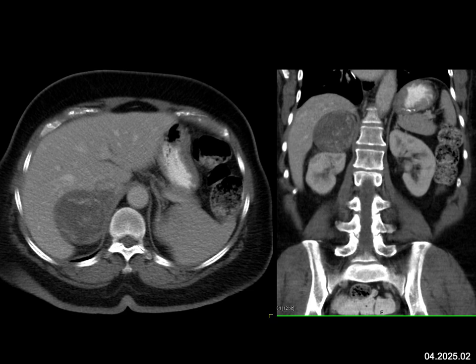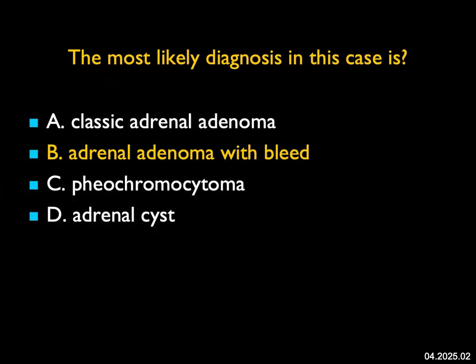A simple adrenal cyst is water density, and this has high density within it. Remember, adrenal cysts, pheochromocytomas, and adenomas can all bleed. The thing we're dealing with most here is a bleed, so the answer — adrenal adenoma with bleed — is correct. Pheochromocytomas are statistically the most common lesion to bleed. Adrenal cysts essentially never bleed. ACCs can bleed, and adenomas, particularly when larger, can bleed. It's often a very difficult diagnosis, typically made following surgery.